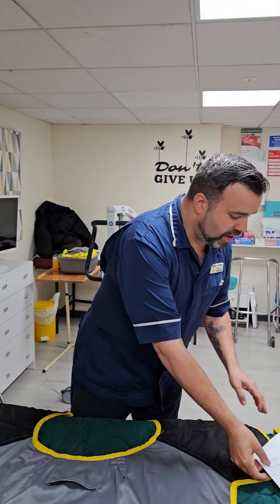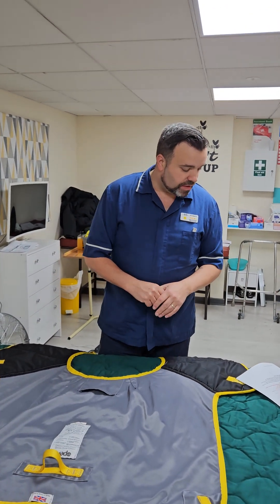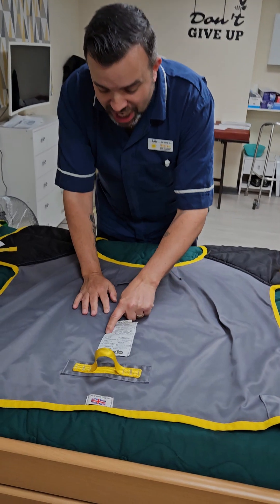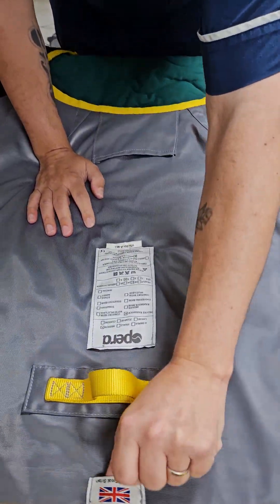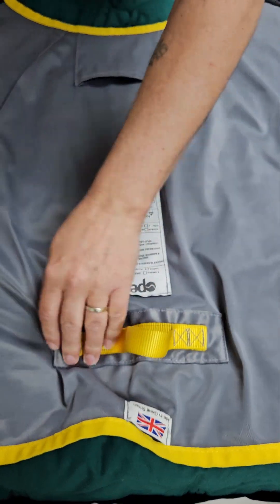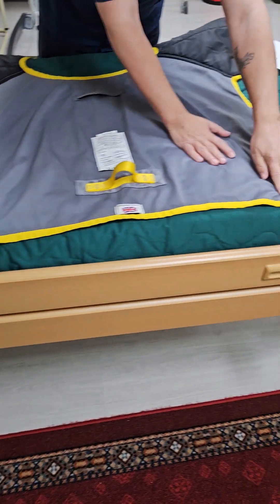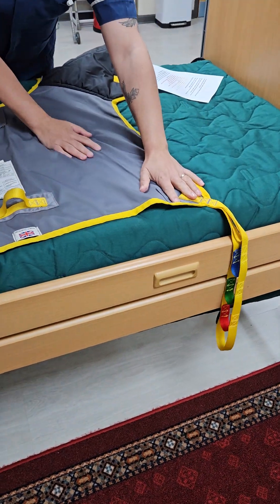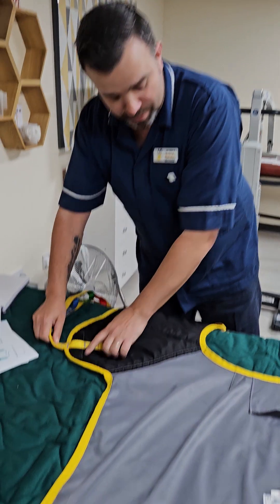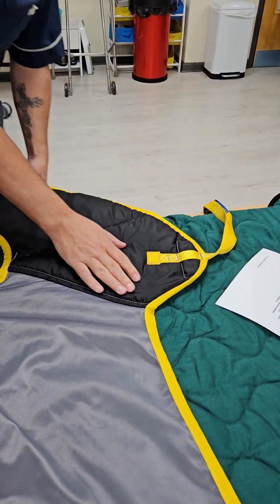So what does the sling check involve? First, we want to make sure that nothing's frayed. We're going to check the stitching and make sure it's all good. We're going to go round and check the stitching on all of the corners, making sure that nothing's frayed. If it's frayed or damaged we wouldn't use it. So we're going to do a visual check making sure that nothing's frayed.